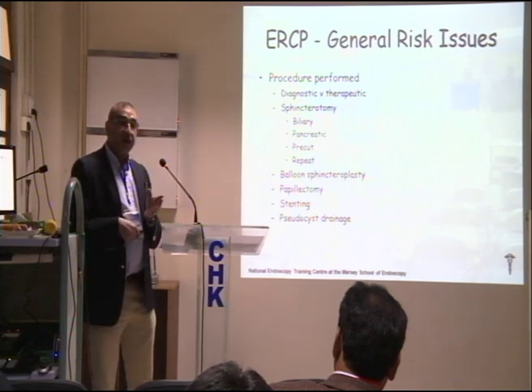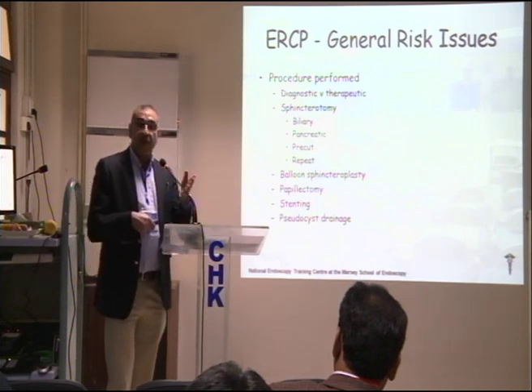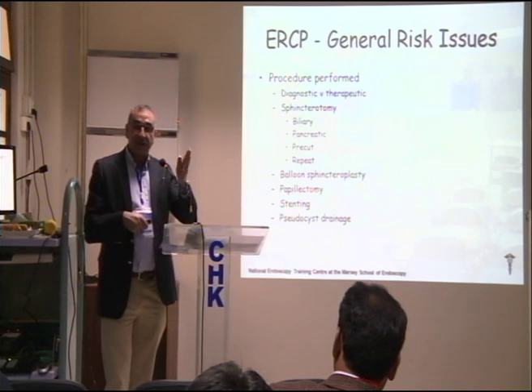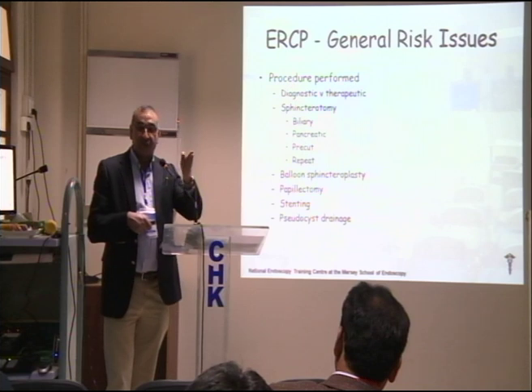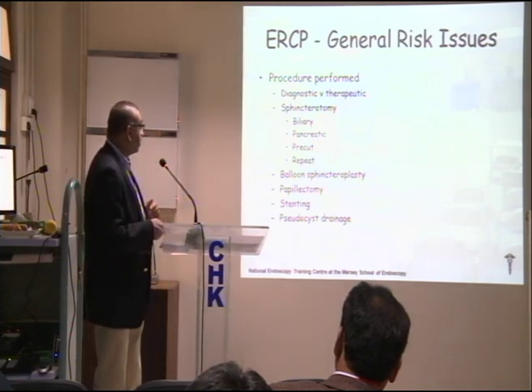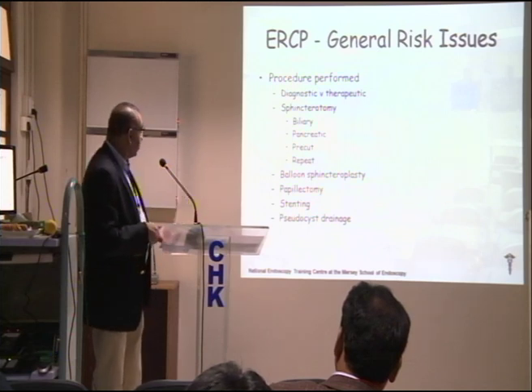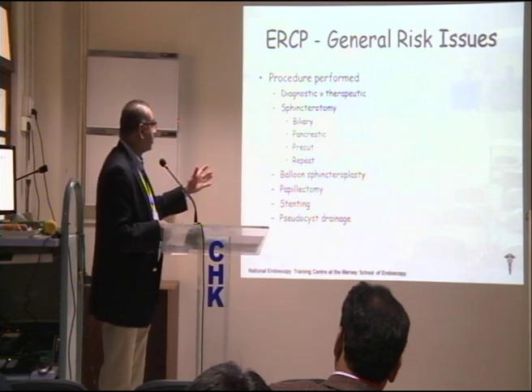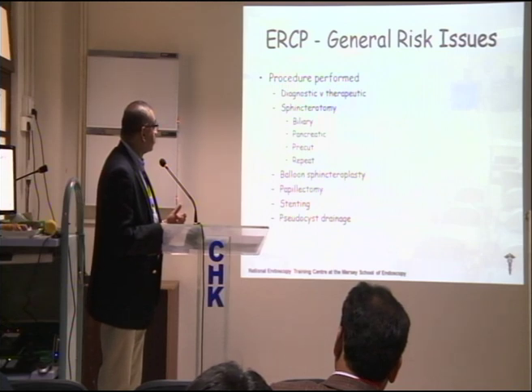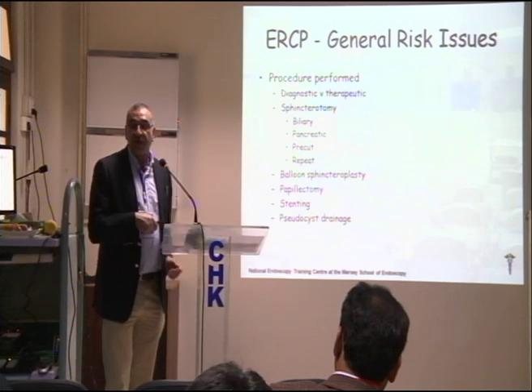If you do deep cannulation and a proper sphincterotomy, you are protected by the line of cut because the cannula is already in the duct, and it tells you where to go for your line of cut. But in pre-cut, you have to make that judgment. And with your experience, I would not recommend it. A repeat sphincterotomy in a patient who has had a sphincterotomy in the past might have stenosed off due to scar tissue. Repeat sphincterotomy is always high risk because of more risk of bleeding.